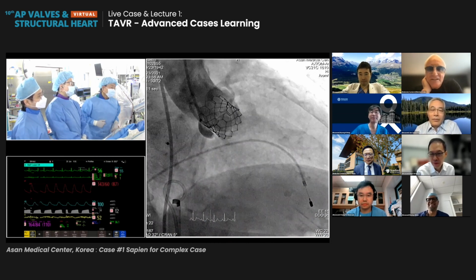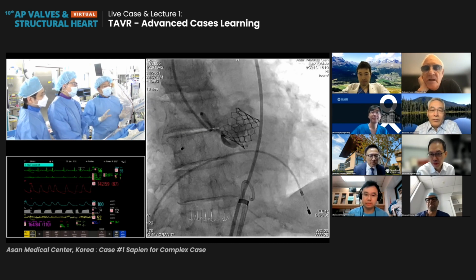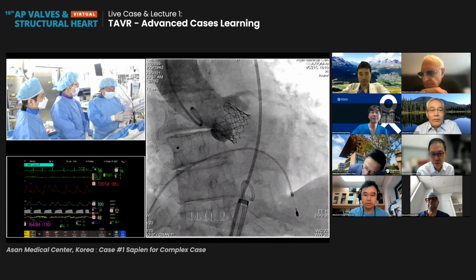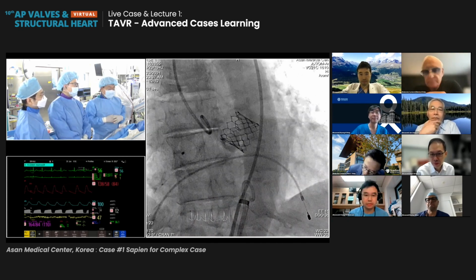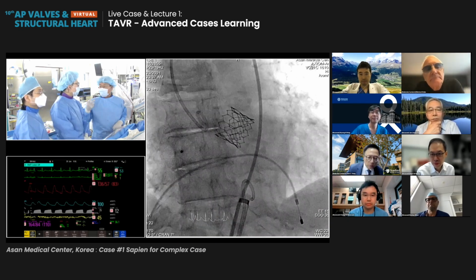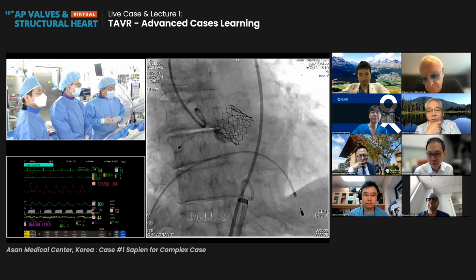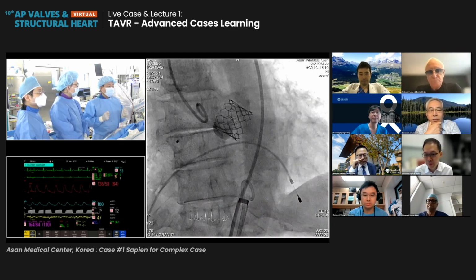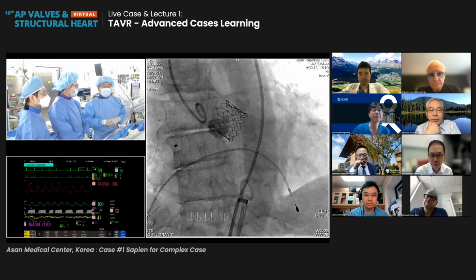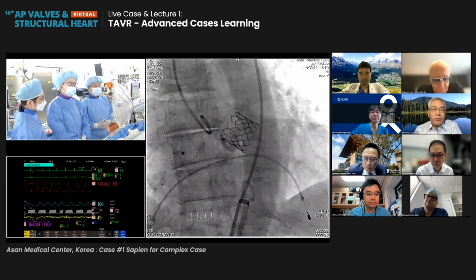However, I don't have too much concern about that one. Honestly, complex anatomies, combined with secondary ASD, something like that. However, procedure-wise, Dr. Lee is really an expert for device closure, so we have lots of experience with TAVR procedures, and we do not hesitate to do a simultaneous procedure for a particular patient. All right, any comment on that one?